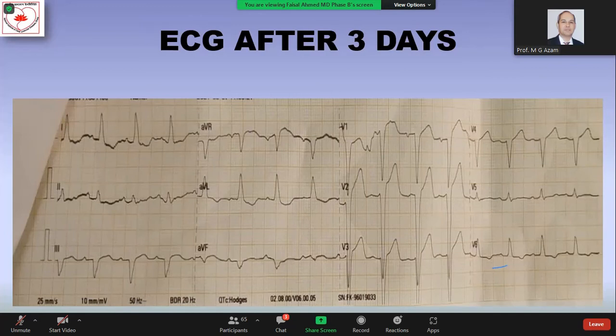No, it is not totally an ECG presentation. It is not totally an echo presentation. It is not totally a case presentation. It gives a sense of how to interpret the ECG, how to proceed further to echo, then go for further investigation and how you make your decision in a very short way.